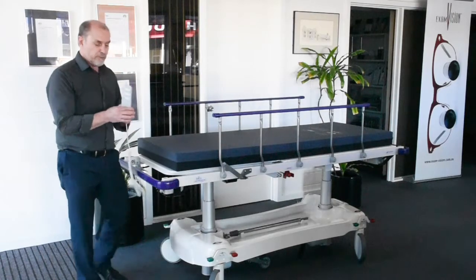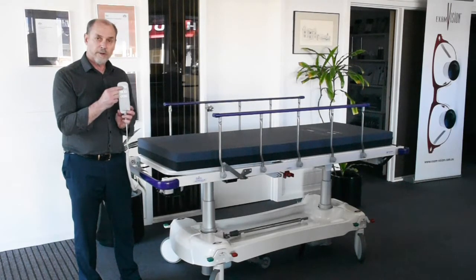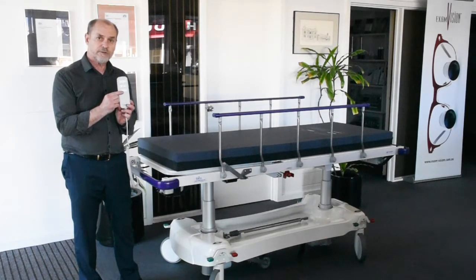It's operated through a three-function hand control. We've got backrest control, high-low operation, and also the tilt function which gives you Trendelenburg and reverse Trendelenburg.